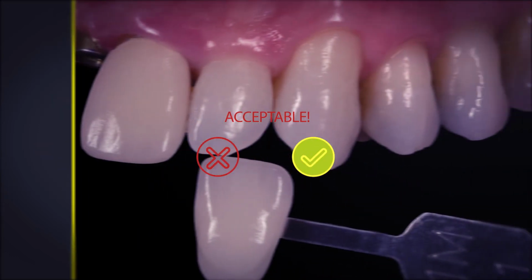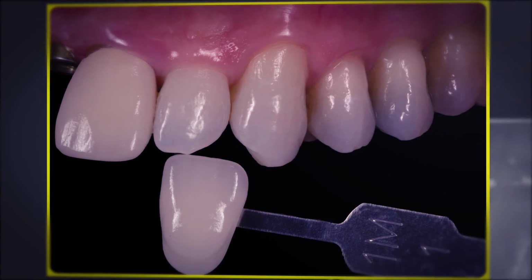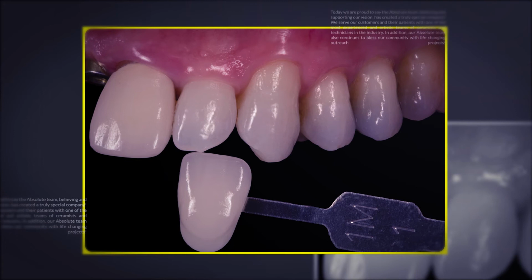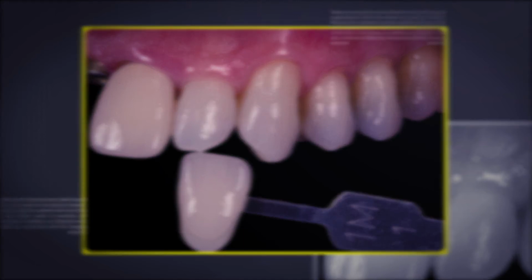Here's an example of an ideal shade picture. The tooth is not dehydrated. We can see the translucent levels. The patient's mouth is open and lips are retracted. The shade requested is based off value, not chroma. And the shade tab and tooth to be matched are held incisal edge to incisal edge on the same depth or plane, and both are in focus.